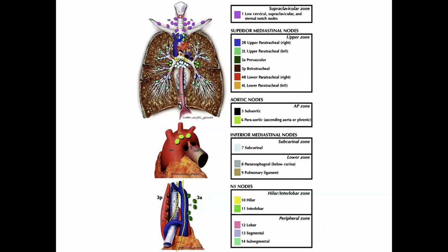So we're going to consider mediastinoscopy. We need to think again just what the lymph nodes are that we're going to be having to explore. This again is a fairly busy slide. It's from the Detterbeck paper. Obviously, station 1 is above the clavicle. Station 2, paratracheal upper. 4, paratracheal lower. We've got the prevascular and the retrotracheal, which is station 3, which we very often don't get too involved with as surgeons. Need to think about the ones again that we can't really access from a standard mediastinoscopy. We may have to consider other options for that. We'll come to that later.